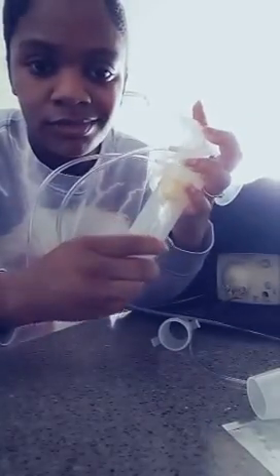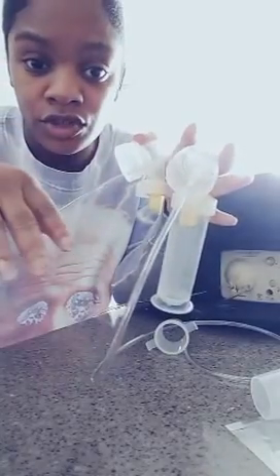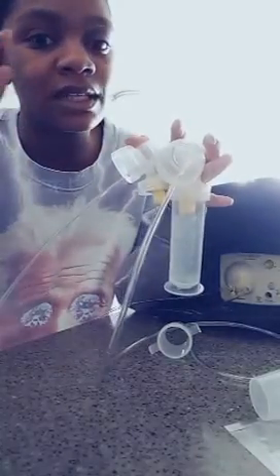But for now, it depends on if you're using a tube. So right now I have a tube or a bottle. They connect the same way. You just screw them on. Same with the bottle. You just screw it on. All Medela things are interchangeable. So you can use the Medela tubes, you can use the Medela bottles, you can use the Medela bags.